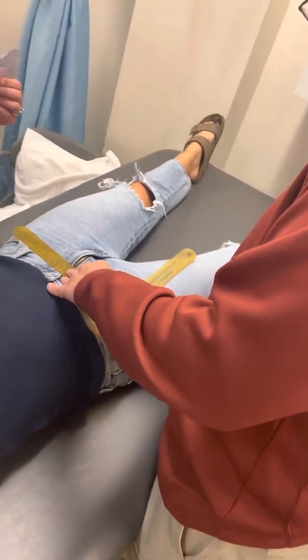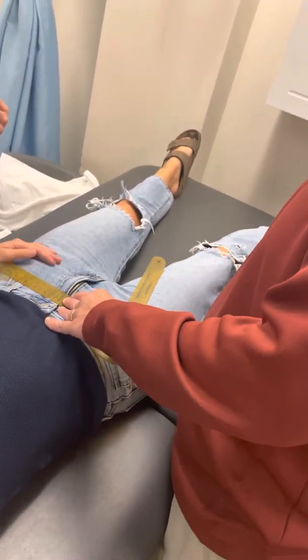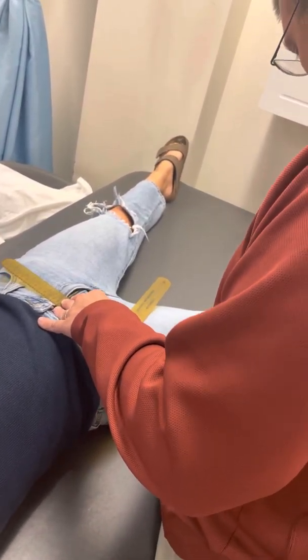So now you're going to move out to the side as far as you can. Do not let them rotate, because she's going to start throwing in hip rotation. There we go. Is that as far as you can go? Right there. All right, that's good.